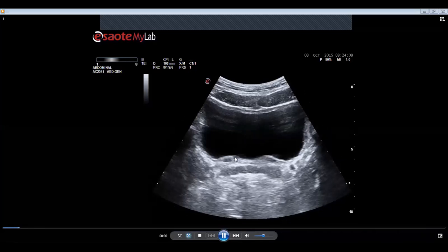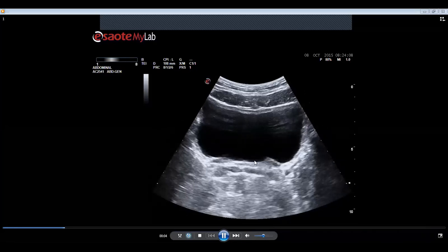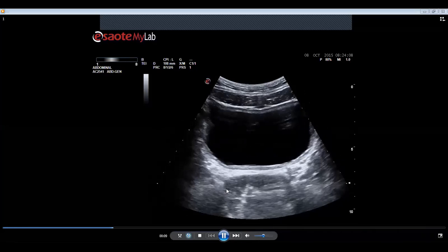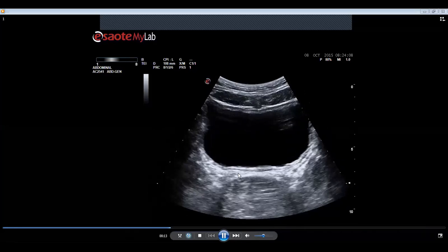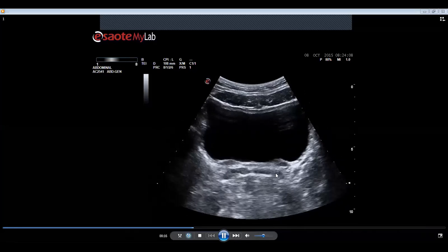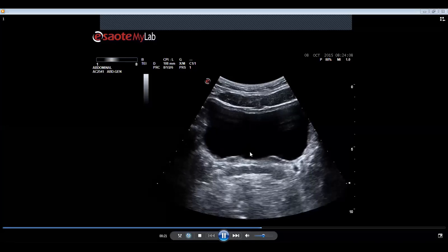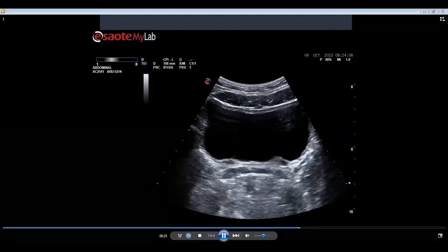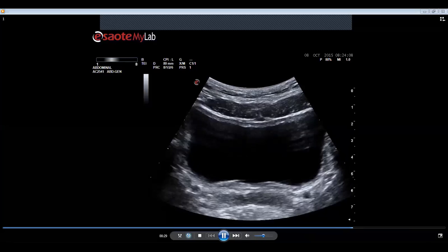Here they are opening on the posterior wall. Behind you can see the black tubes of the seminal vesicles, the right and the left. This is right, this is left. So this is the right ureter opening into the bladder. This is how the distal vesico-ureteric ends are seen.